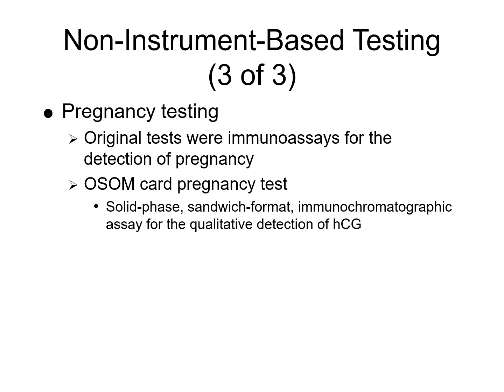Again, best practices: we're going to, once again, follow the manufacturer instructions carefully. We're going to use fresh or properly stored urine or serum specimens. And then you can confirm positive results with clinical correlation if needed. So if you get a positive urine test, you can always come to the lab with your doctor's order and get a serum test, and we can actually do a qualitative or quantitative test with that. We want to make sure that we maintain QC checks for batch and lot validation.